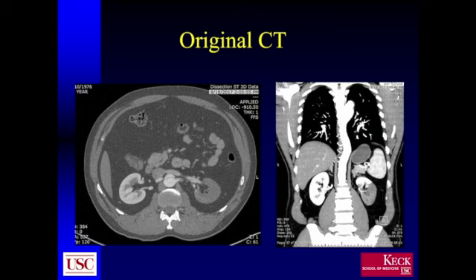In this particular case, the clinicians wanted to know what to do with him since it was now 48 hours after the initial CT, and you can see that the contrast ultrasound confirmed that the findings seen on the original CT remain, and that basically the kidney was non-viable after 48 hours.